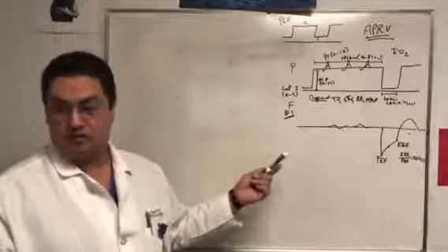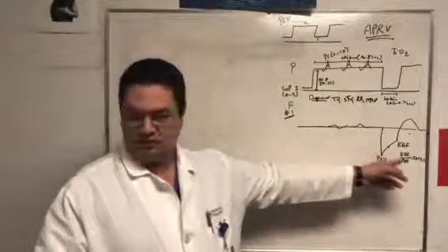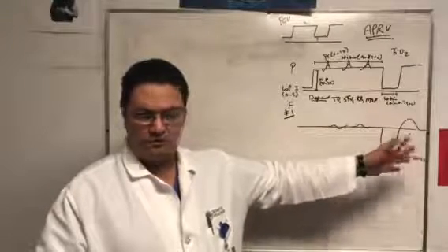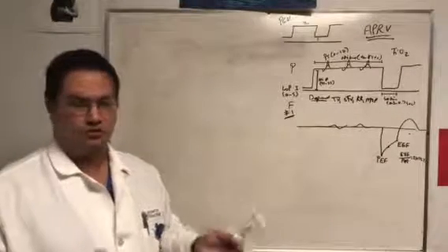APRV every 2 hours when it's APRV. And during that evaluation, they have to do this measurement of the ratio. If it deviates from around 50% or so, they tell you and you see what you want to do. But I also encourage you and the nurses to do the same.